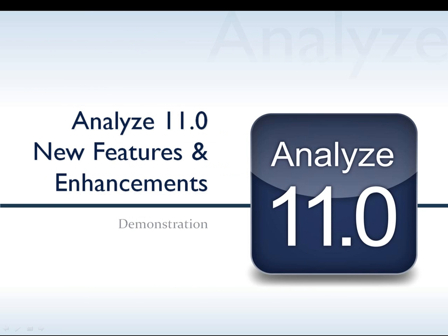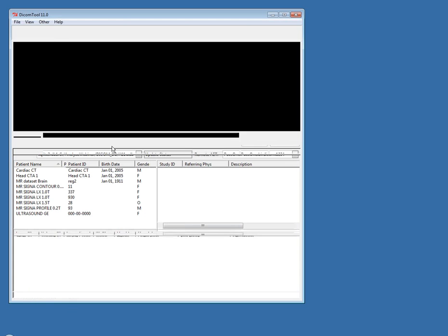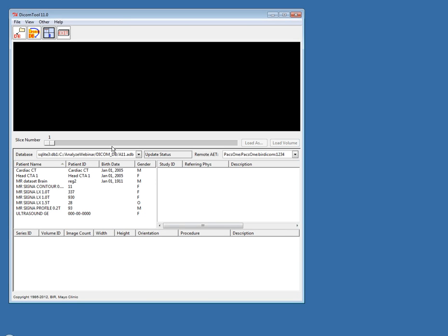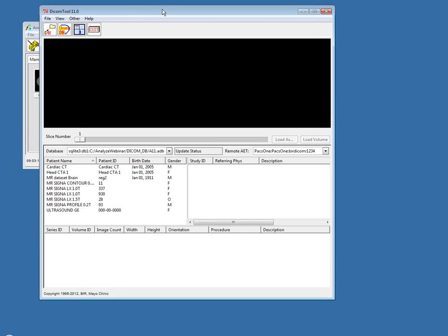I'm going to go ahead and jump right into our demonstration of some of these new features and enhancements. I'll begin with the DICOM tool. Within the DICOM tool, there are some new options for anonymization.